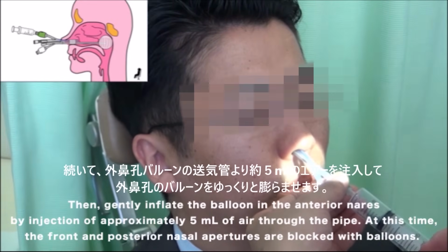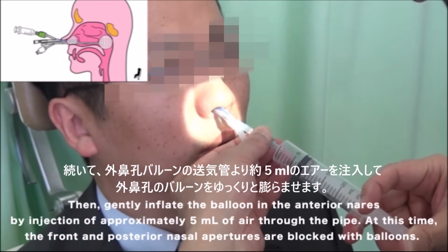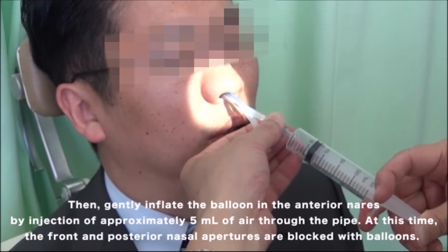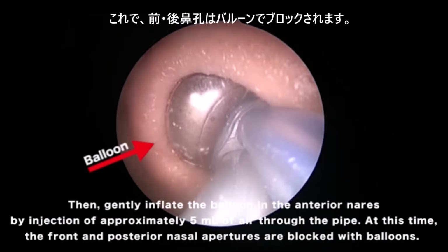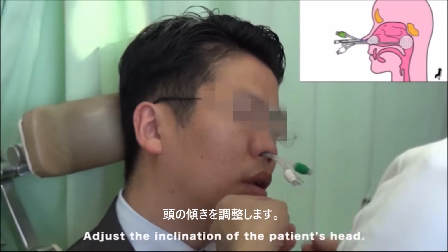Then, gently inflate the balloon in the anterior nares by injection of approximately 5 milliliters of air through the pipe. At this time, the front and posterior nasal apertures are blocked with balloons. Adjust the inclination of the patient's head.